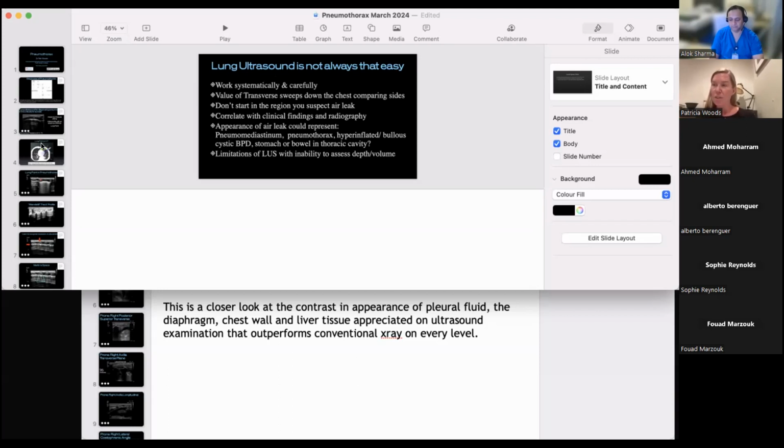One other thing you could do is reposition your baby. Think about whether there's any separation of that pleural space, and whether it continues with air moving. It's not that reliable, I found. I've done that occasionally when it's come to doing a chest needling and the air isn't conveniently sat at the second intercostal space, mid-clavicular line. You move the baby a bit more laterally, wait 5-10 minutes, come back, and hopefully the air leaks in a nice central area. But I think you just have to go back to clinical context.